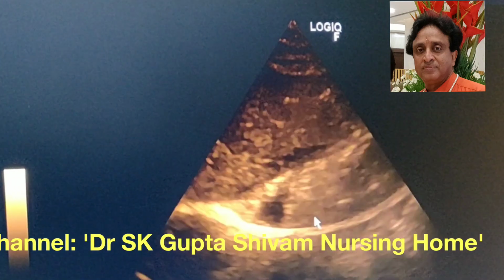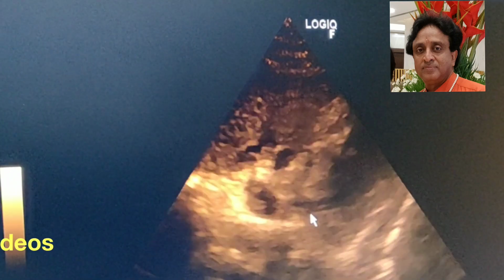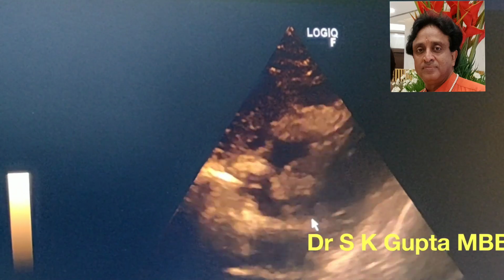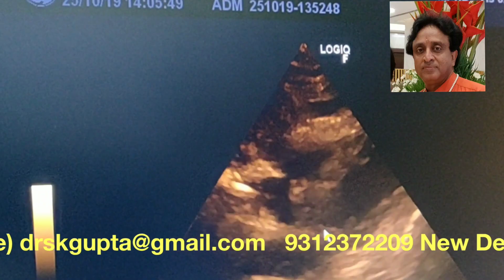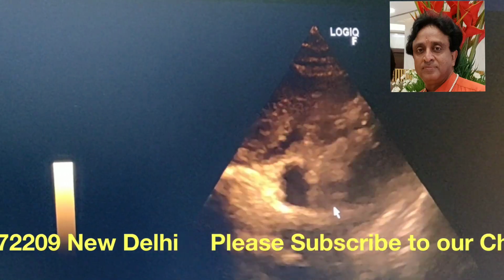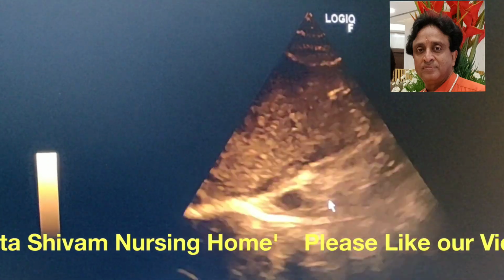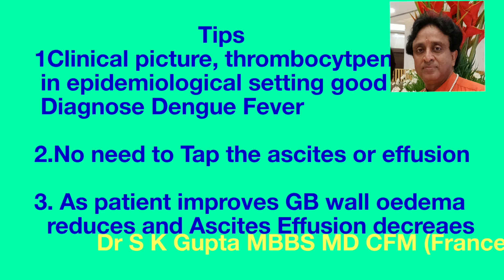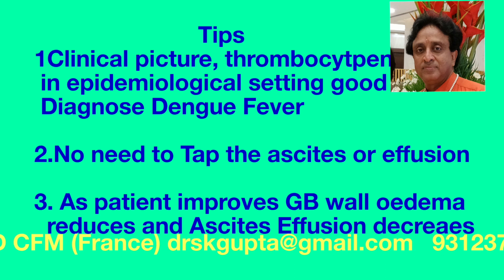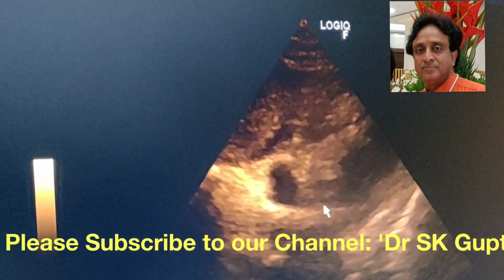So this is a case of dengue fever with ascites. We are saying it is dengue fever because, though there is fluid around the gallbladder fossa, there is no probe tenderness, and the patient has symptoms suggestive of dengue fever. Her platelet count was found to be 80,000, and her dengue serology was found to be positive.